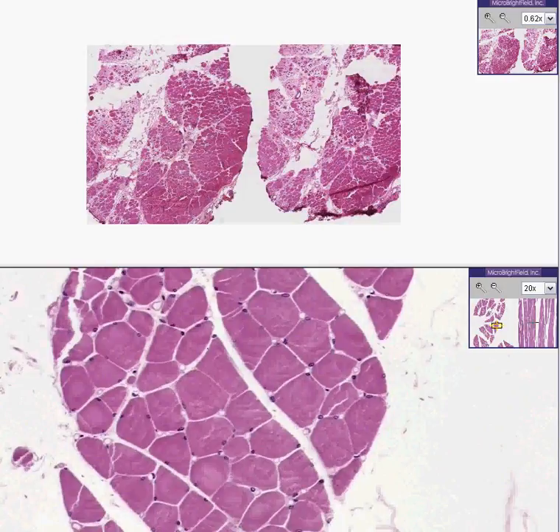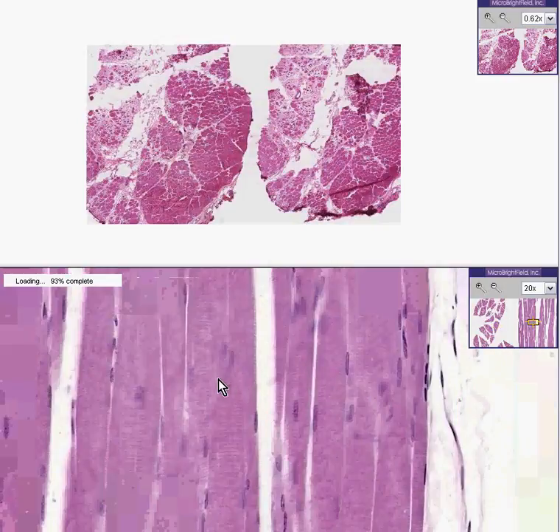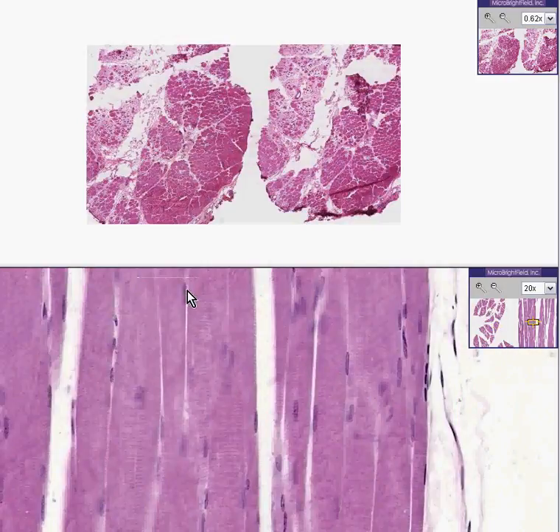This is what that same exact muscle might look like if you were to cut it longitudinally — nuclei at the periphery again, and nice striations.